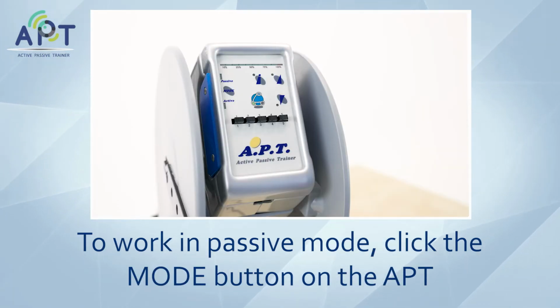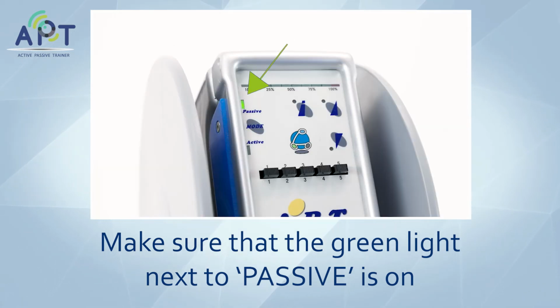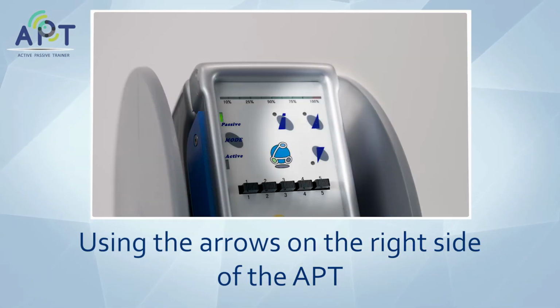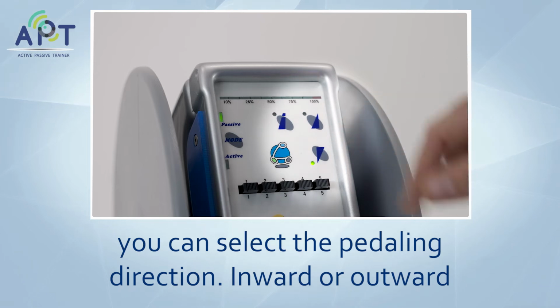To work in passive mode, click the mode button on the A.P.T. Make sure that the green light next to passive is on. Then, click on passive on your screen. Using the arrows on the right side of the A.P.T, you can select the pedaling direction, inward or outward.